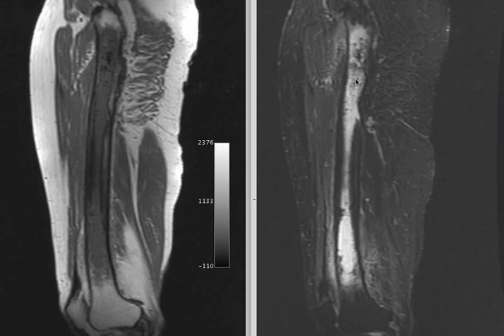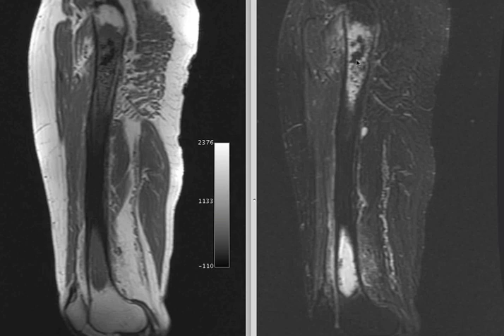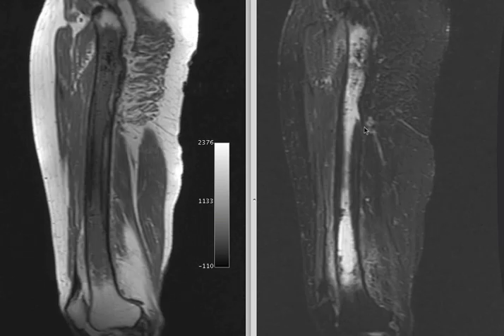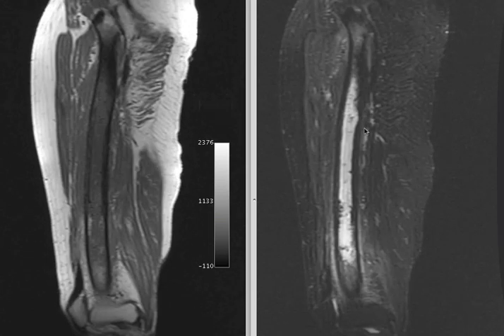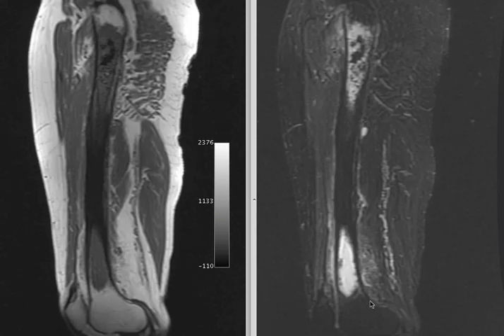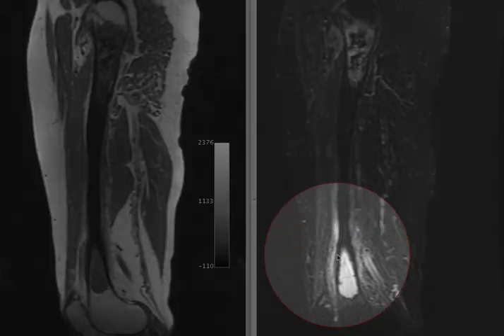This is the heterogeneity that we saw in the tumor, where proximally there are very low signal foci on T1 and on T2 that correspond with the calcifications. As we go further down the femoral shaft, the signal is somewhat more homogeneous, but we can see how extensive the signal is, going all the way down to the distal femoral diaphysis.